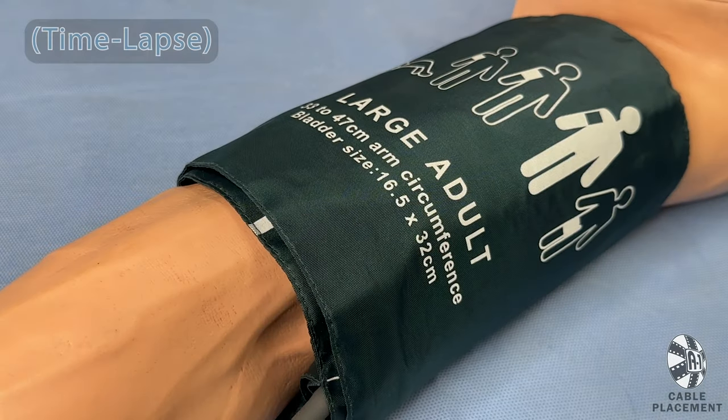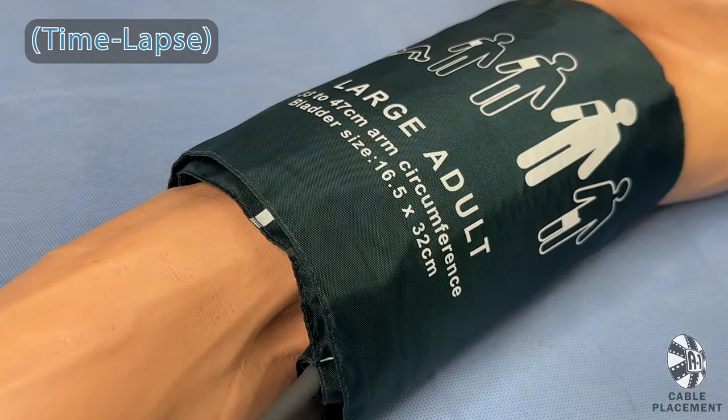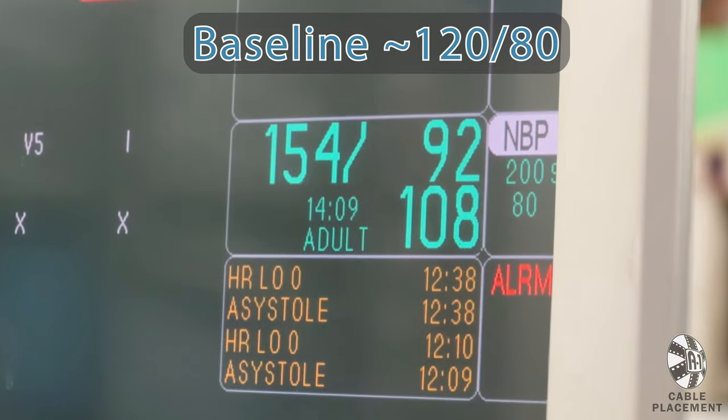This will inflate the cuff around your patient's bicep for about a minute or so. Once it beeps and deflates, the blood pressure will be shown on screen. 120 over 80 is the most common baseline pressure for a healthy patient.